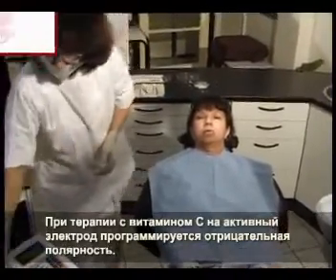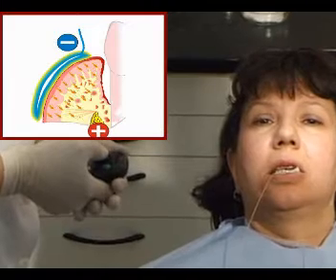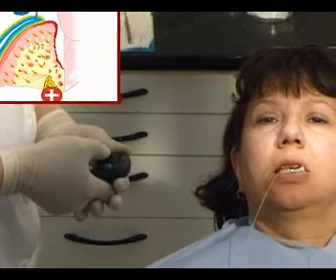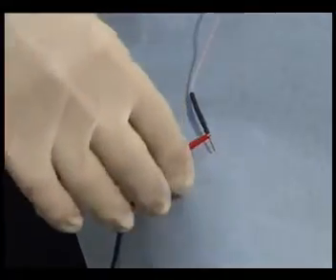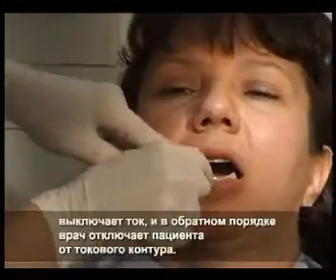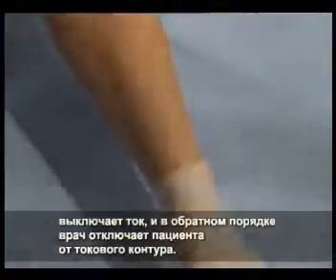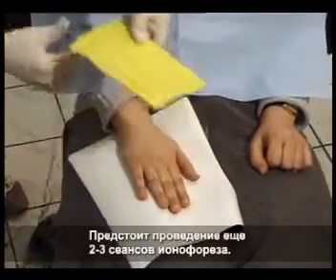In the case of therapy with vitamin C, the active electrode is programmed with negative polarity. The patient is left in peace until the procedure ends. When the procedure ends, the device gradually exits its current mode, stops the current, and the dentist switches the patient off the current circuit in reverse order. Two to three ionophoresis procedures should be performed for the patient.